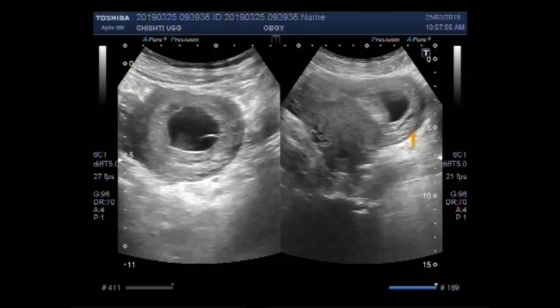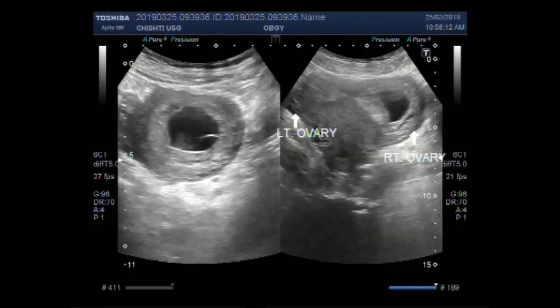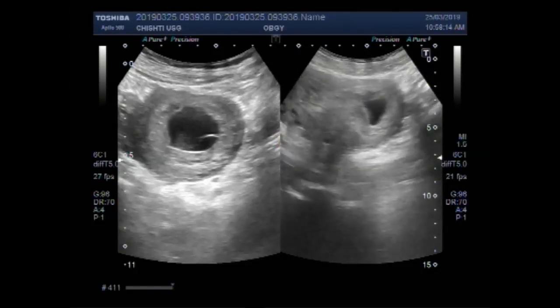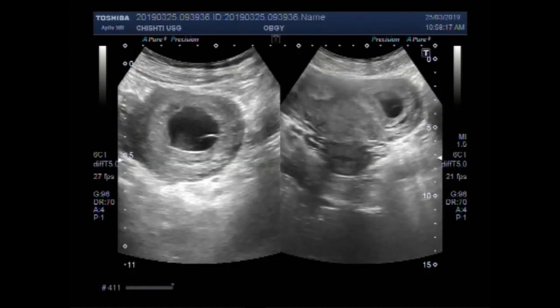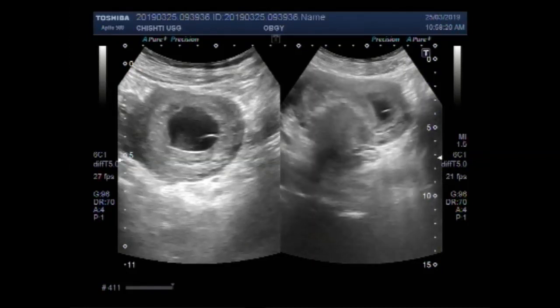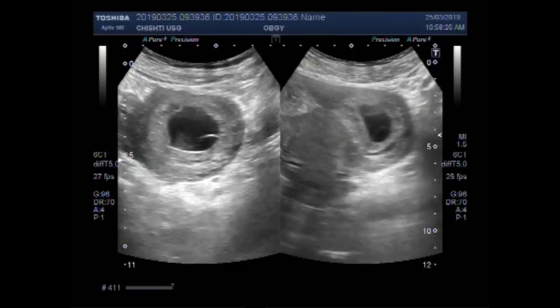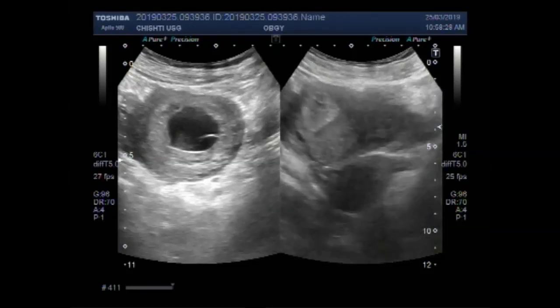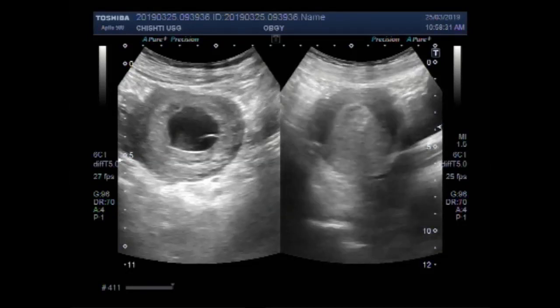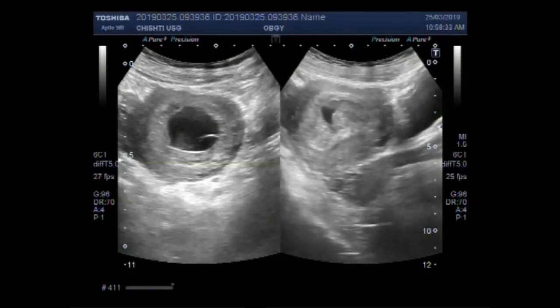This is the right ovary, and this one is the left ovary. Only small clots are visible inside the gestational sac.